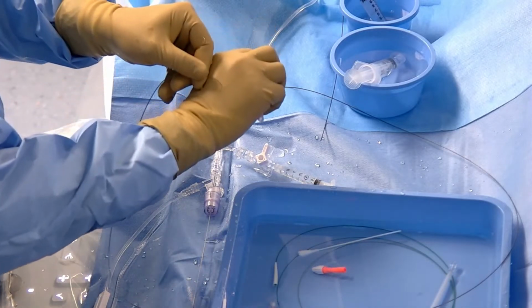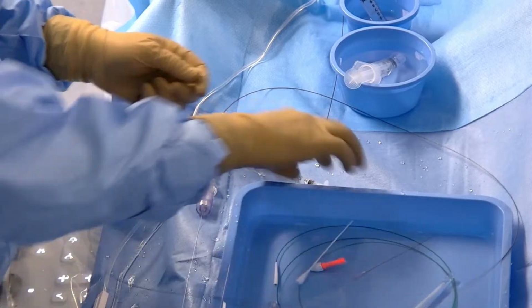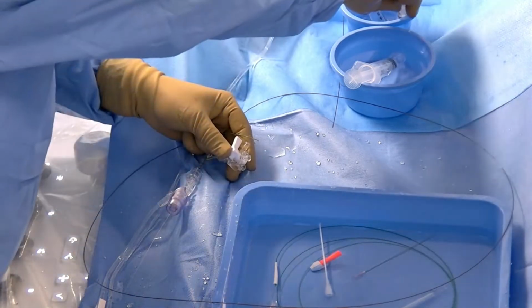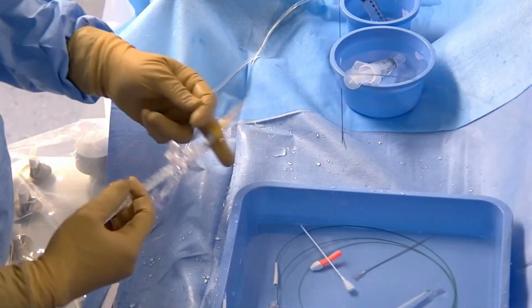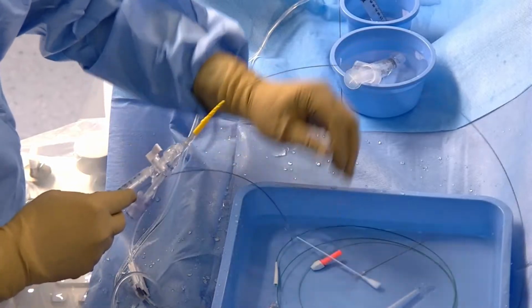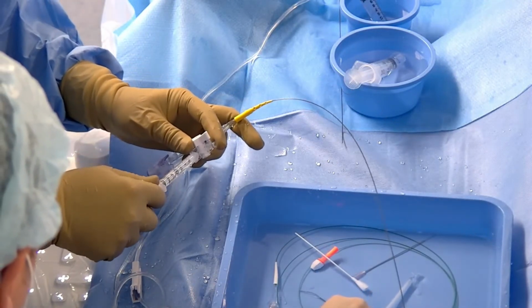I did a small curve here and a J curve here. This is how many percent? 64. 60. Okay, I will put a little bit more. You already prepared this? Yeah. Okay, balloon is prepared. Now I will put in the water and deflate the balloon.